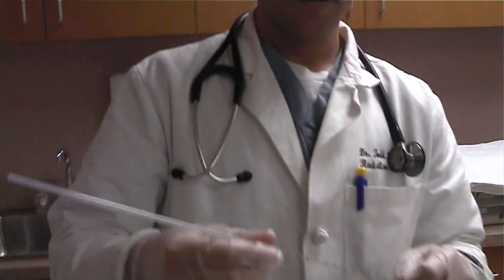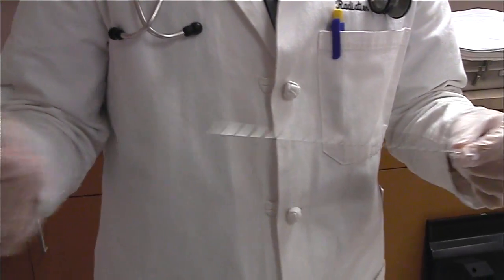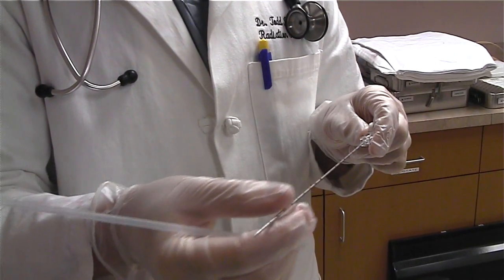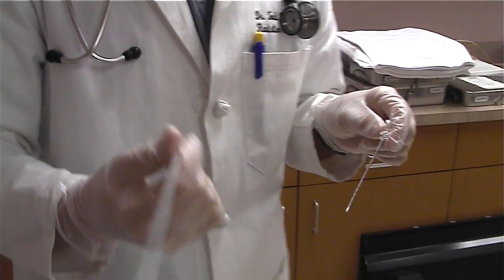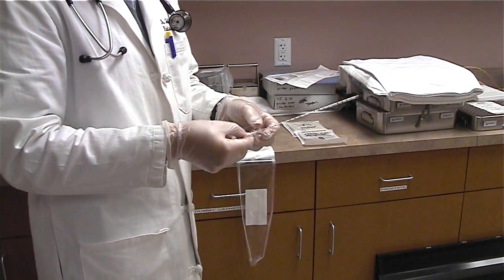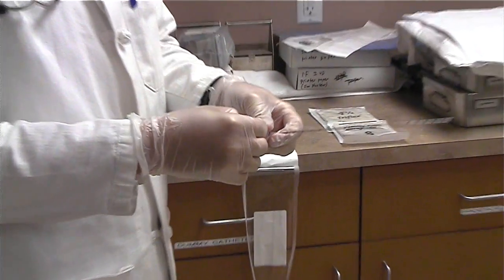This is the actual needle and there's bone wax in the end of the needle, and the seed is actually inside the needle here. You have to take off the sheet and there's a little protector tab here that keeps the inner stylet from getting ejected.